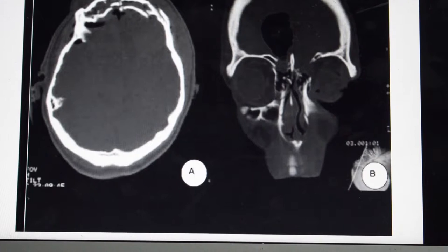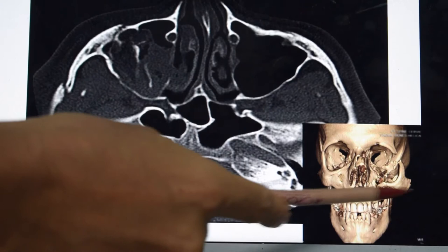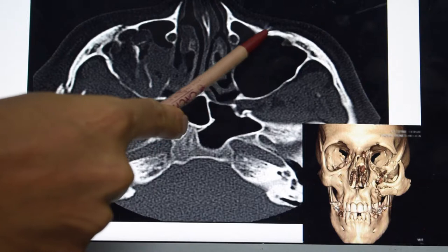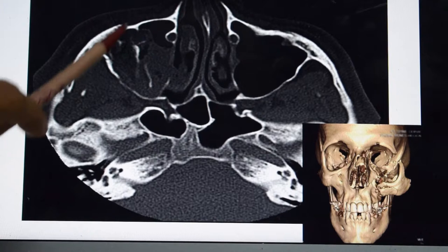In this scan you can see the cheekbones — both the right and the left. There is a cheekbone fracture here. If you see the right side there is continuity, with only very subtle minor fractures, so grossly it appears continuous. But on this side you can see a fracture line here and here — at two places this cheekbone, known as the zygoma bone, is fractured.